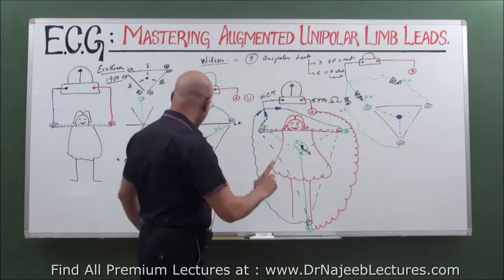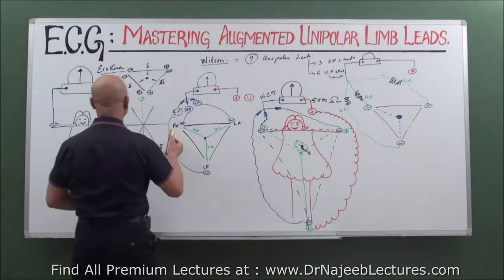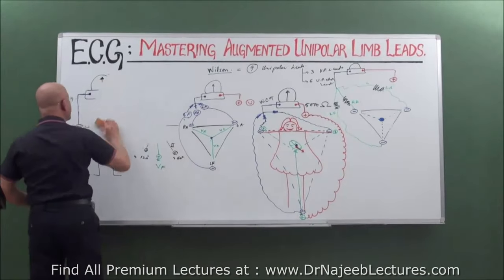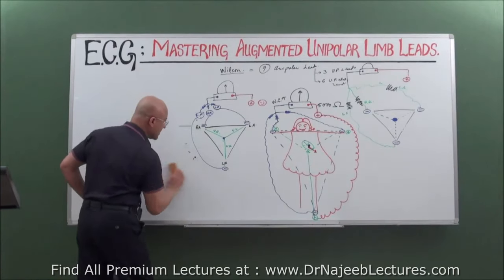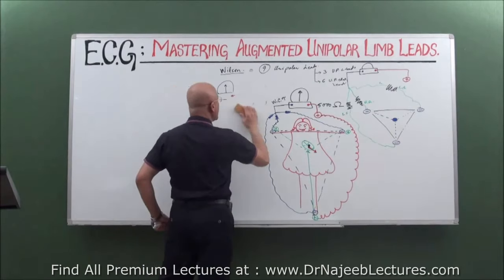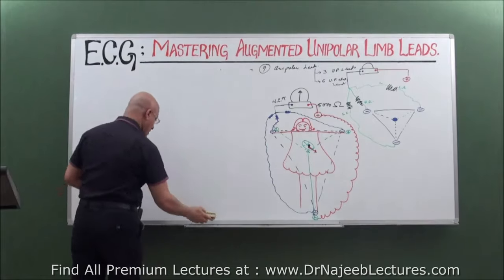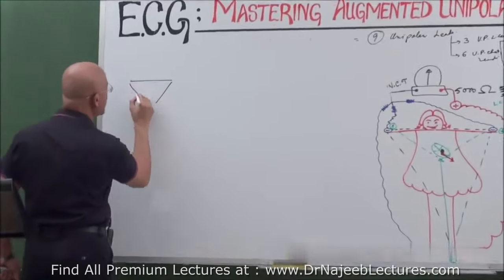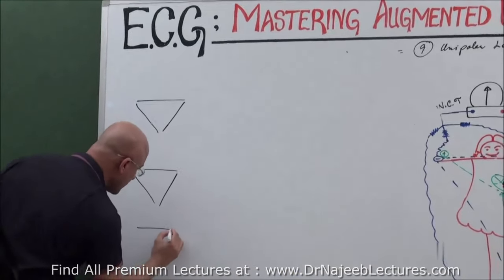Clear? So this is what Mr. Wilson did. So let me compare here bipolar leads and unipolar leads, what we have learned up to now. Then we'll go into further detail. I'm going to make a certain arrangement of the leads, okay? And you have to tell me which lead I'm drawing.